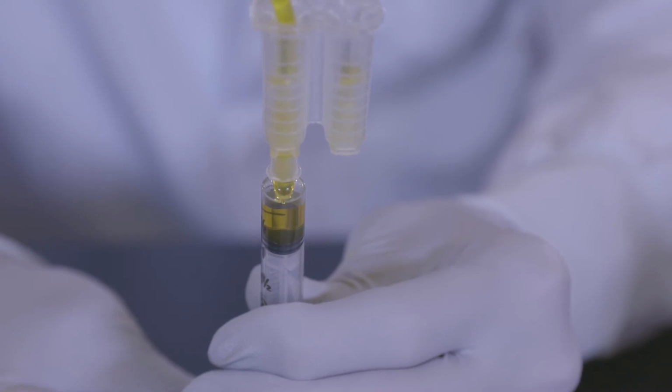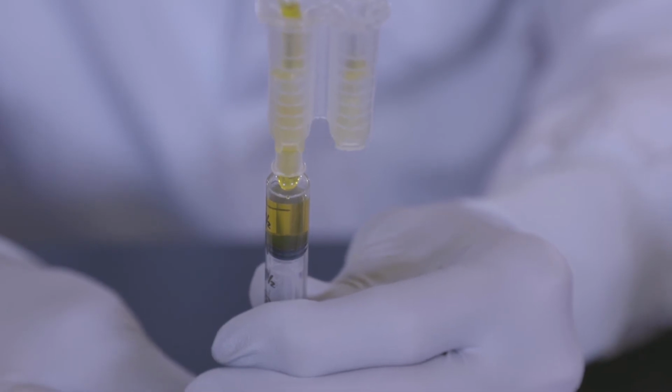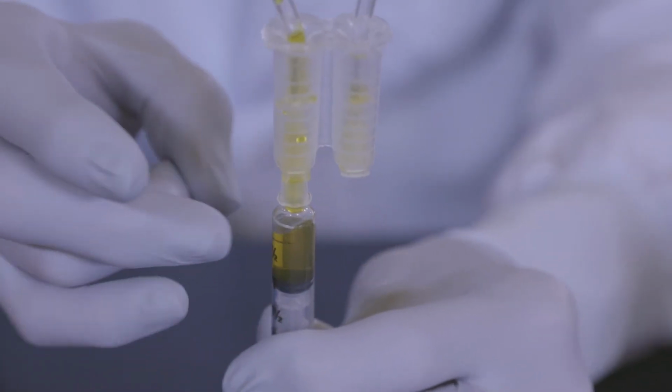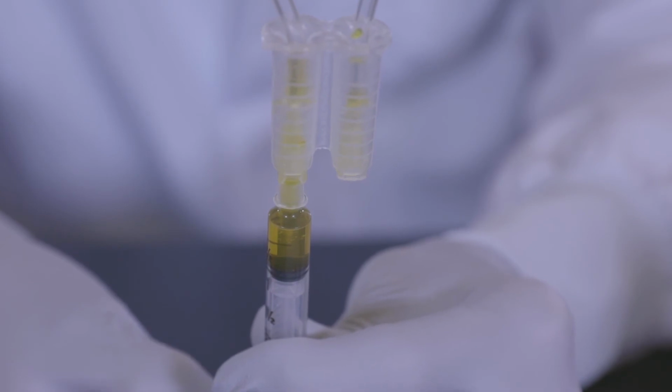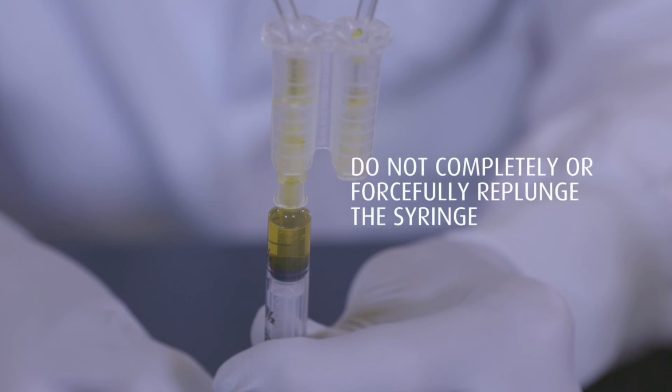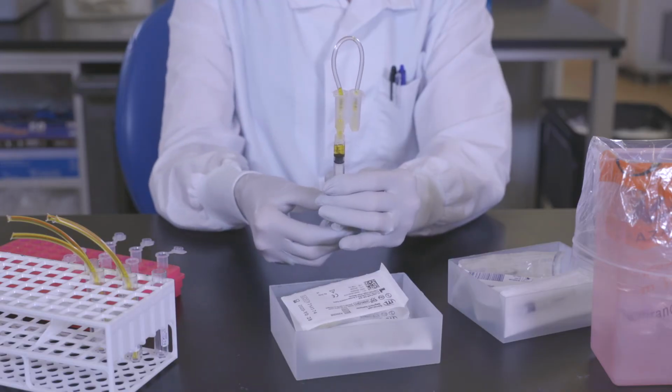To remove bubbles, hold the segment sampler and attached syringe in a vertical position. Tap the syringe so that the bubbles move to the top of the fluid column in the syringe. Once the bubbles are at the top of the syringe, gently replunge the fluid back into the segment, just enough to remove the bubbles from the syringe back into the segment. To reduce potential for sample exposure, gently replunge the syringe contents into the segment. Do not forcefully replunge. Continue to plunge the syringe until the required amount of sample is left in the syringe.